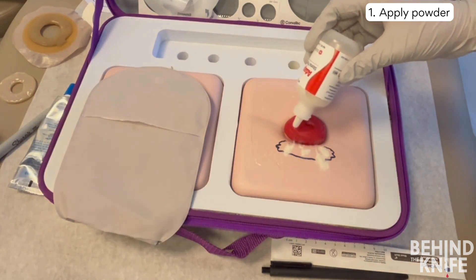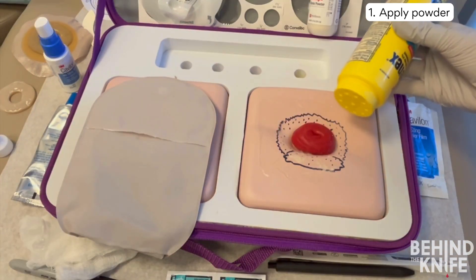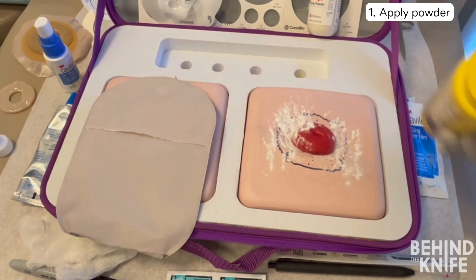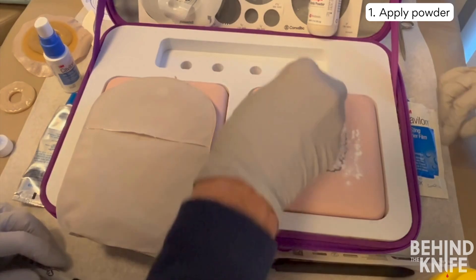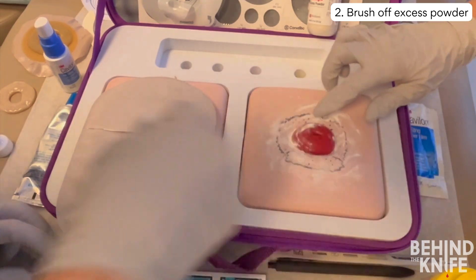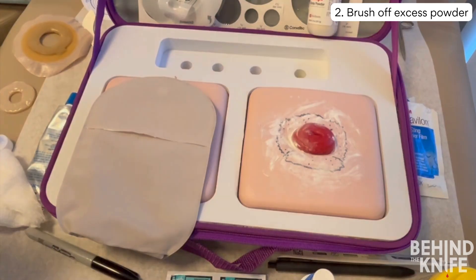Step one when dealing with irritated skin is to apply a powder. You can use stoma powder or an over-the-counter antifungal powder. Apply enough powder to completely cover the raw skin, then use a piece of dry gauze or your hand to lightly brush off the excess. The powder will stick to the areas that need it, as raw skin tends to have extra moisture.